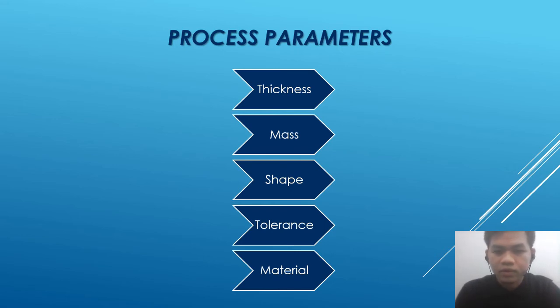Next is tolerance. Dimensional tolerance is a very crucial aspect of the manufacturing process of the knee prosthesis surgical implant. The lower range of tolerance allows the product to be produced more accurately, which will improve the product's dimensional accuracy. Selective laser sintering allows the product to be produced in tight tolerance, from 0.2 up to 0.8 millimeter.